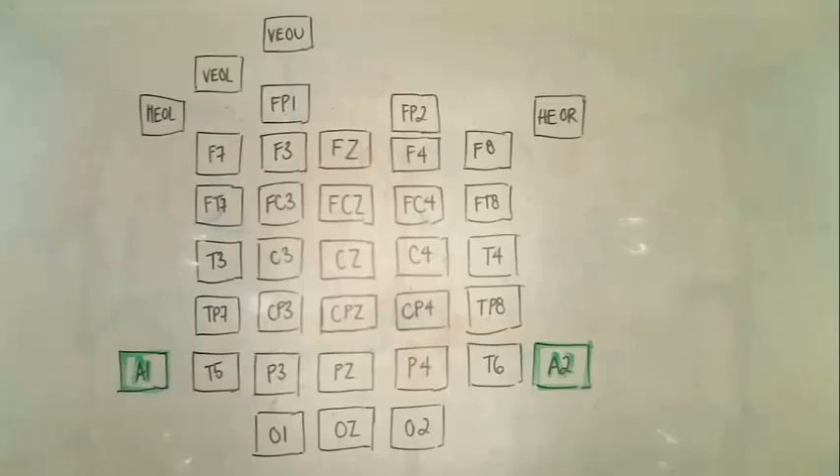A1 and A2 are the reference electrodes and in our lab are placed on the mastoid. The HEOL and HEOR are the left and right temporal electrodes. The VEOU and the VEOL are the upper and lower eye electrodes.